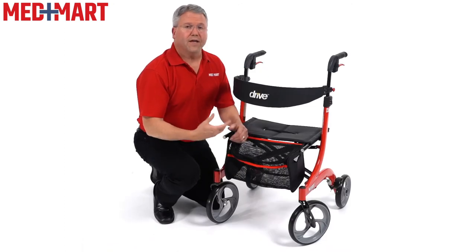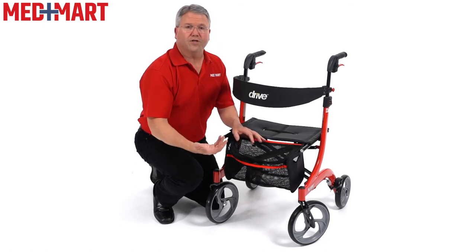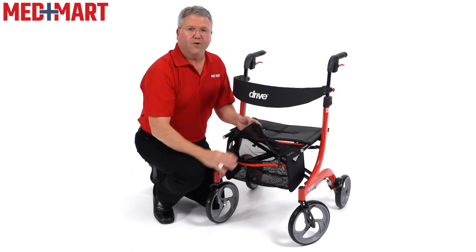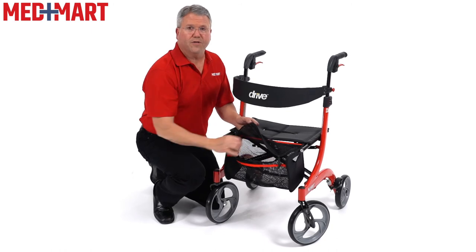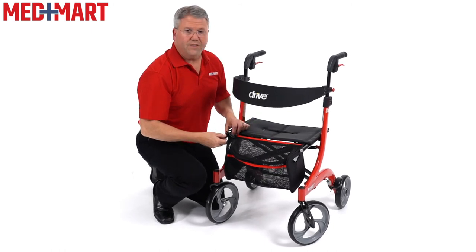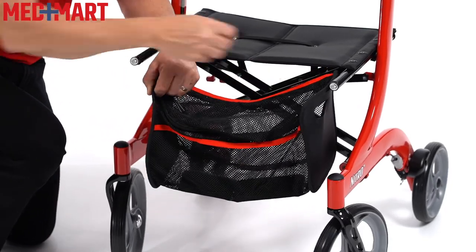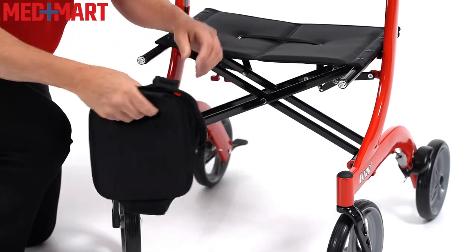When out using the rollator, it's important to be able to keep things on it or shop with it. This has an oversized bag which makes it easy to open up and keep a small purse, wallet, cell phone, things like that. Or if you're out shopping for the day, you can put some small items in here. If you want to take the bag with you, it's very easy to just undo one end, slide that off, slide the other side off — it even has a little handle to hold onto — making it easy to travel with the bag as well.